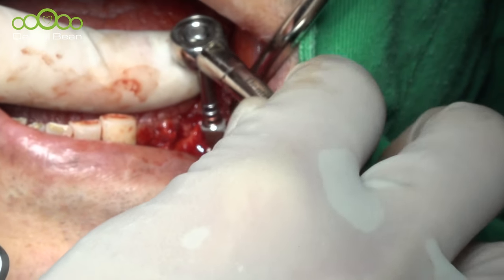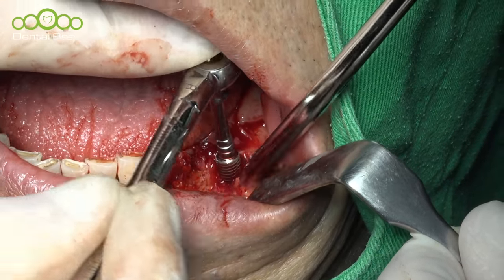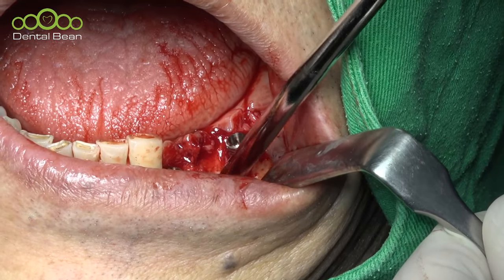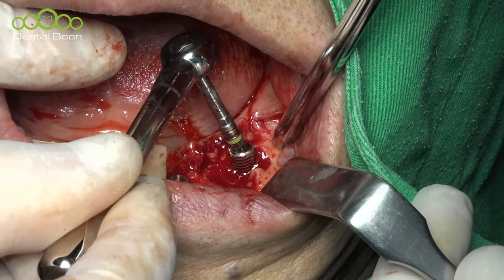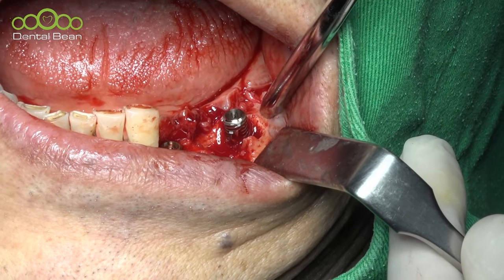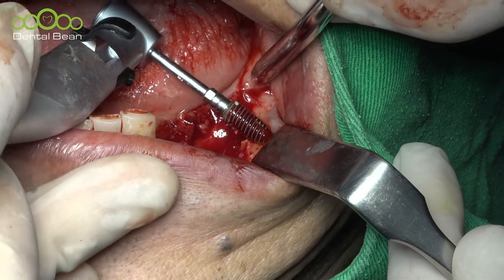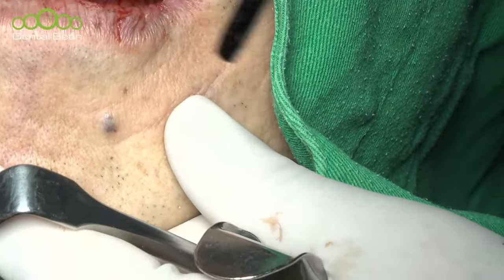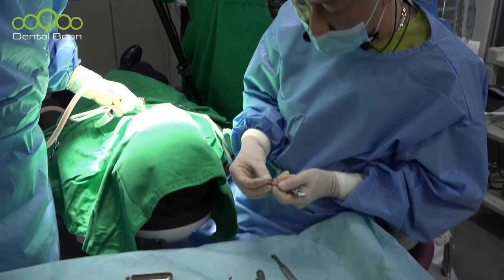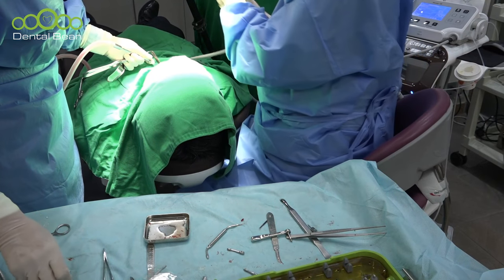Wait, too high. This too high initial stability. Implant removal, and then more drilling. Okay, reverse. Right here, you can keep this implant to the kid. And then, more drilling, the 4.5. This is the 4.5? 4.3. This is the 4.5, okay. Okay, re-drilling.